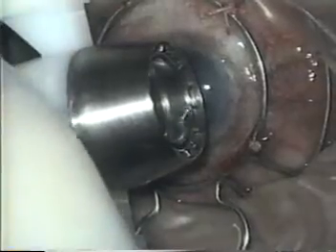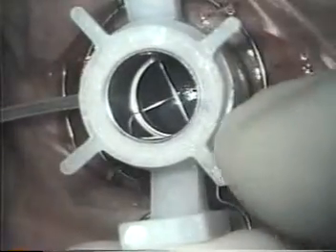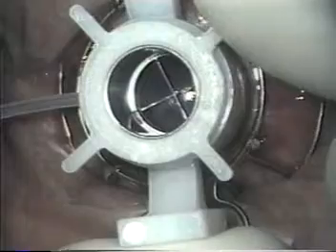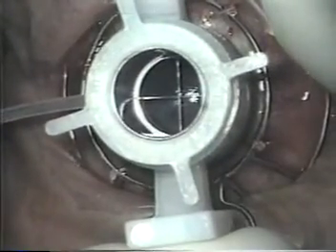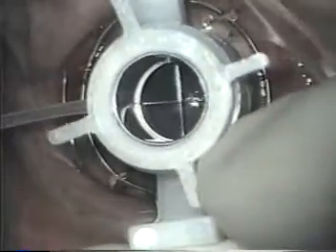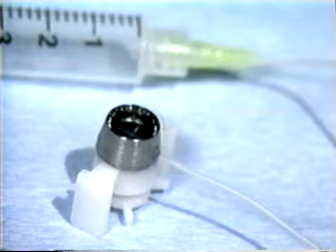The blade assembly itself is made up of a movable circular blade, crosshairs for centering, and spokes which are turned clockwise to lower the blade and make an incision or counterclockwise to retract it. For each spoke turned, the blade is lowered or raised six hundredths of a millimeter. The Barron radial vacuum trephine is available in diameters of six to nine millimeters in half millimeter increments.